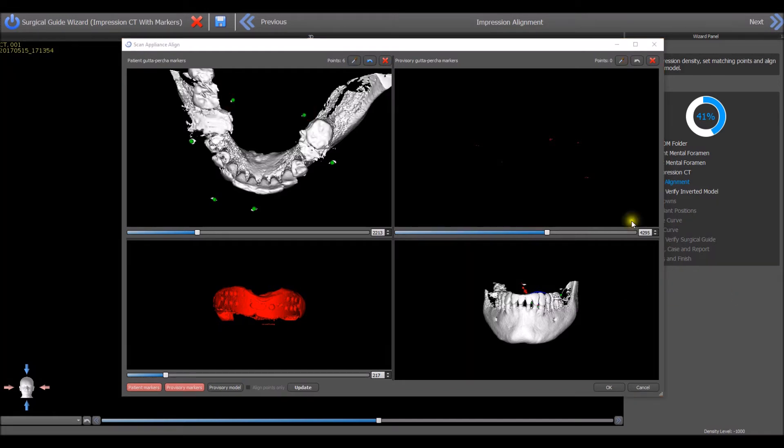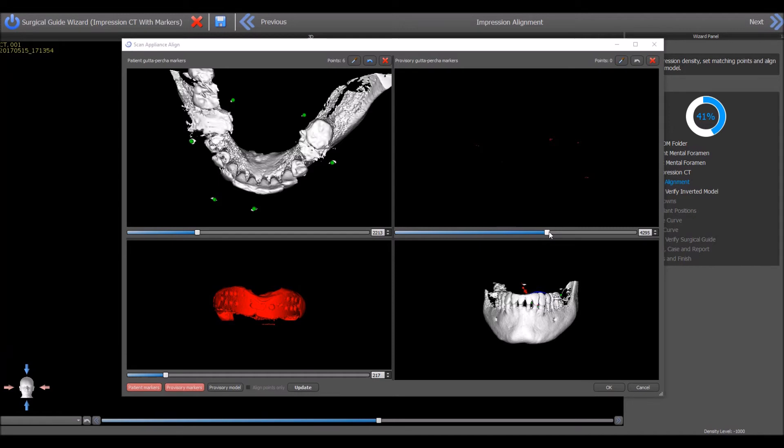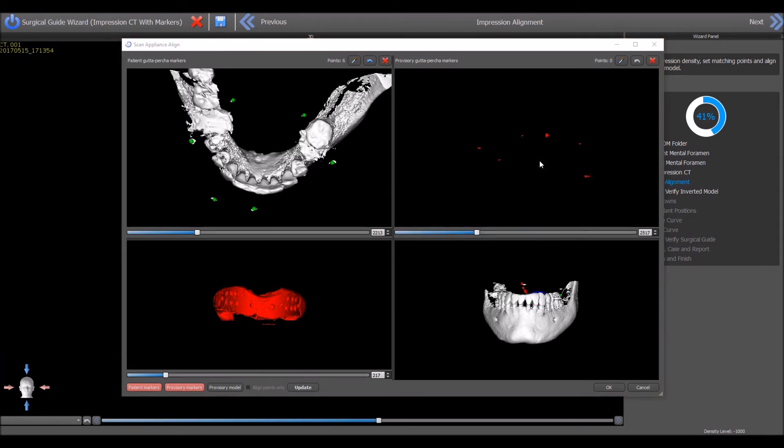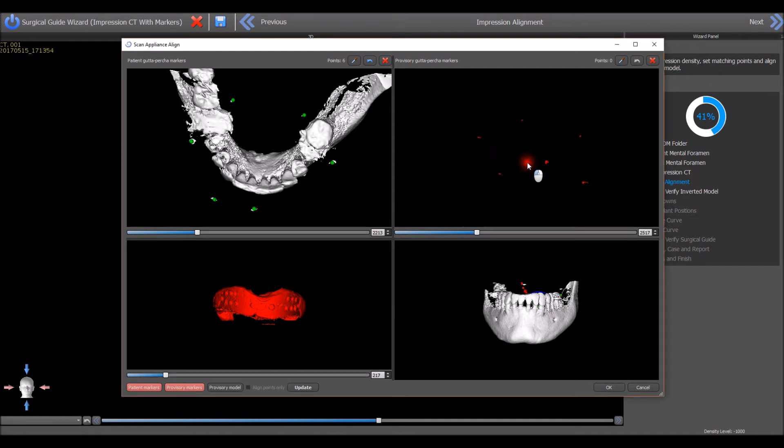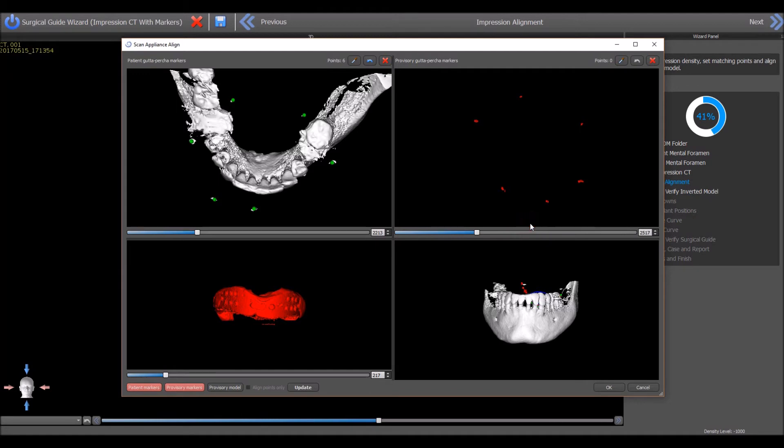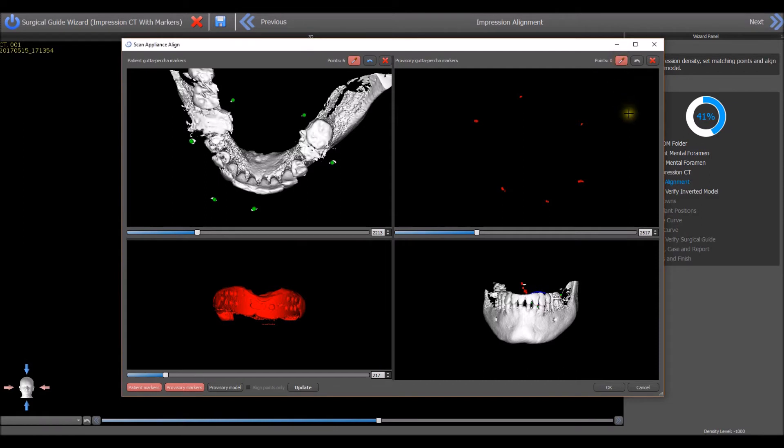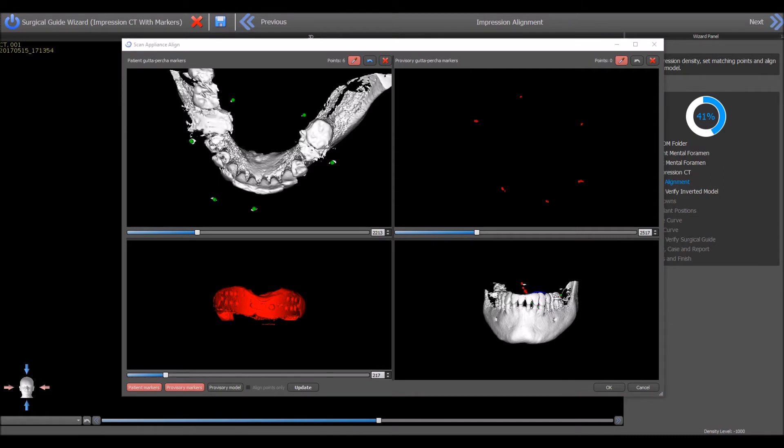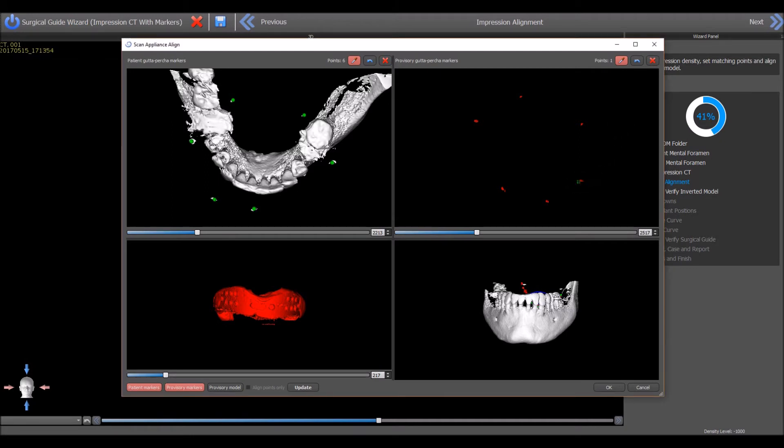In the top right quadrant view, the Impression Scan view, left-click to grab and drag the slider to the left to see the markers more clearly. Hold the left mouse button and move the mouse to orient the markers in the same general positioning as the markers in the Patient Scan. Left-click on the marker icon. Left-click on each of the scanned markers, placing a green dot on each marker.